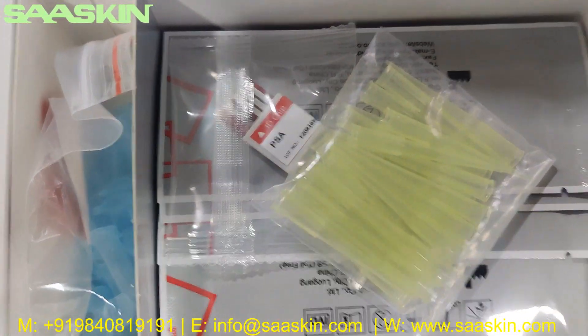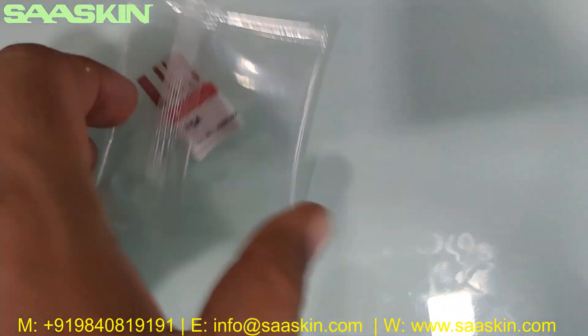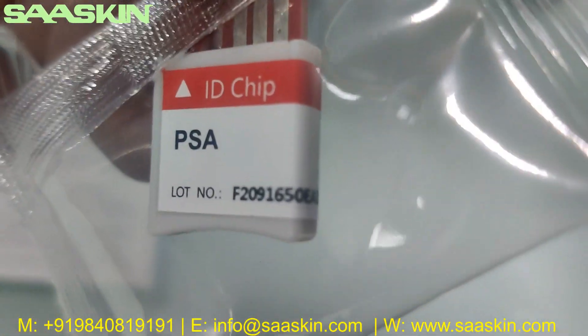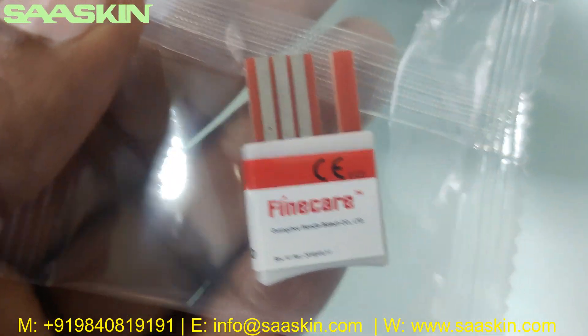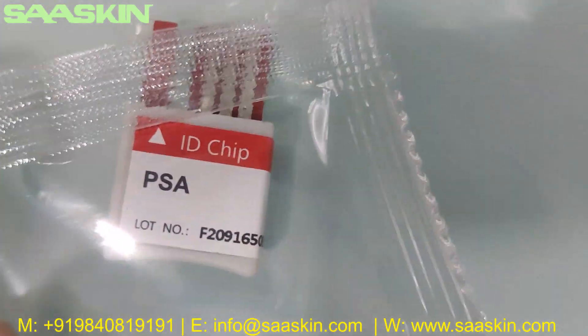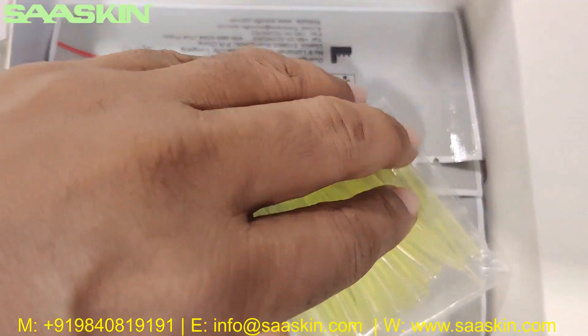Inside you can also see there is an ID chip. The ID chip says PSA along with the lot number. The back side says FineCare. So you get a chip that identifies the test type as PSA and includes the lot number.